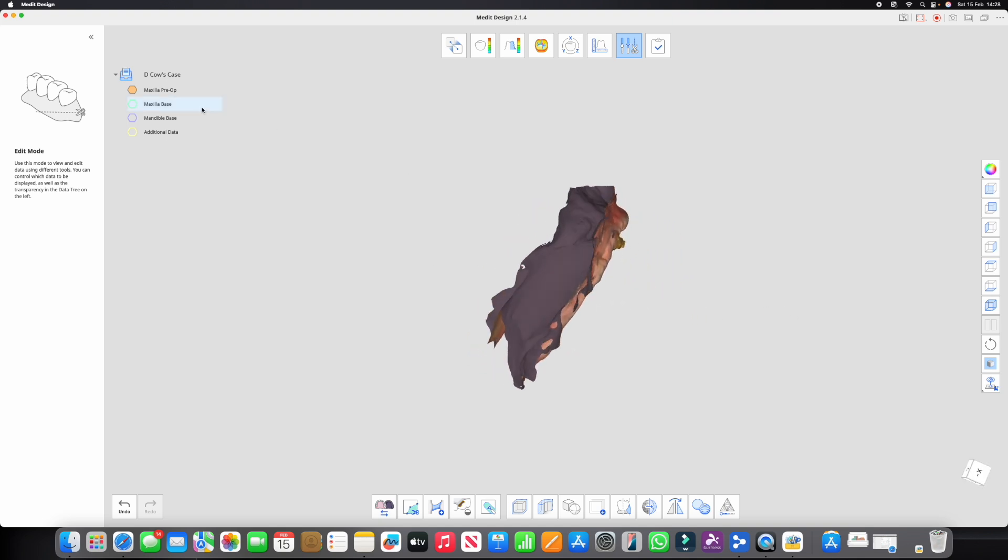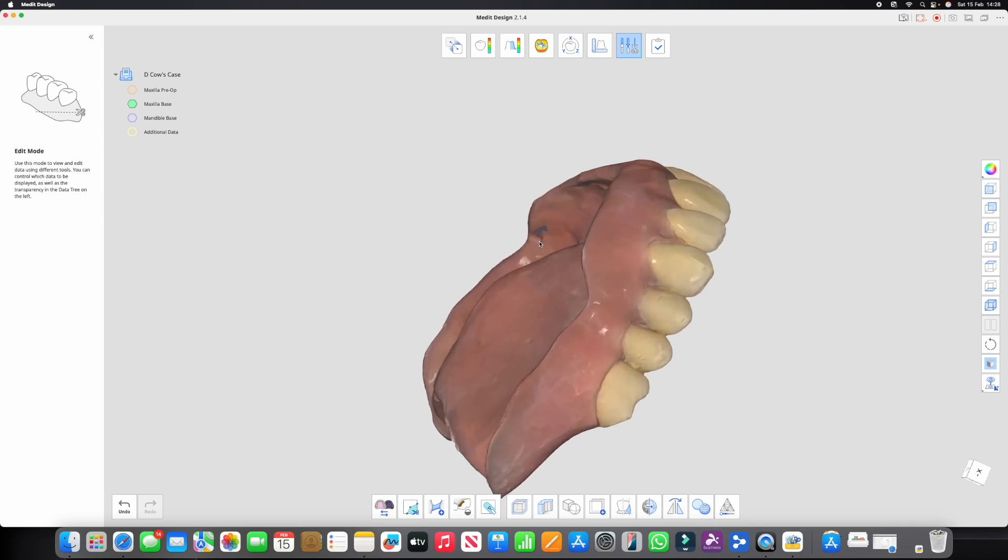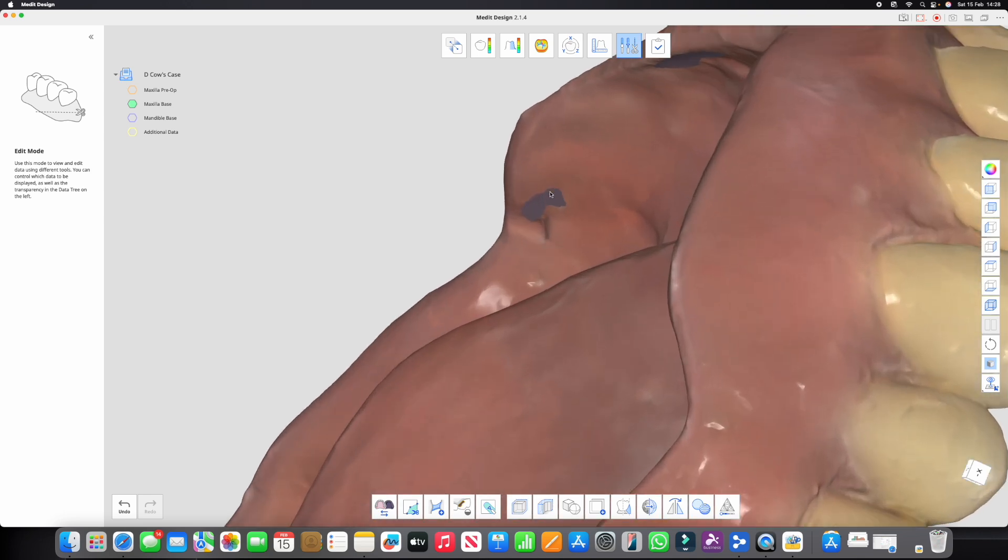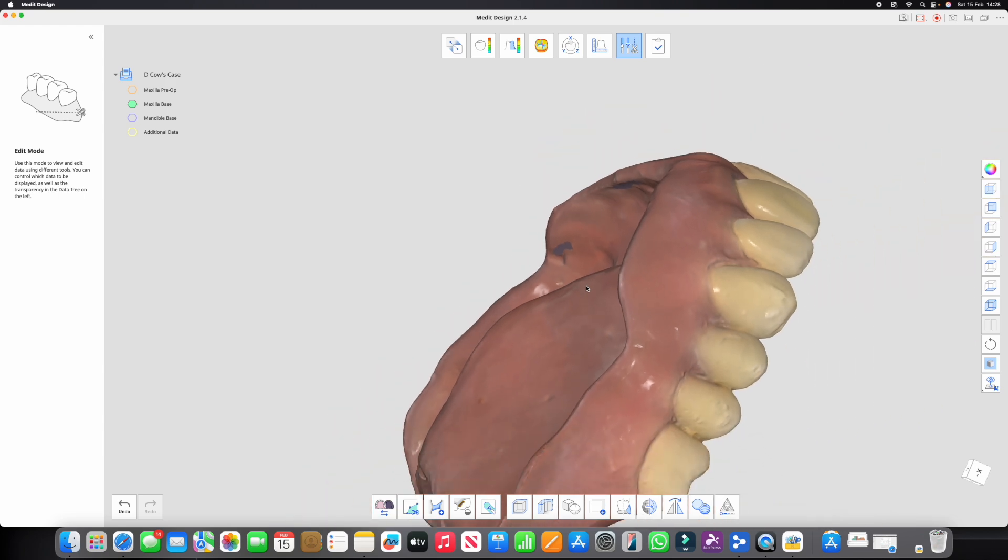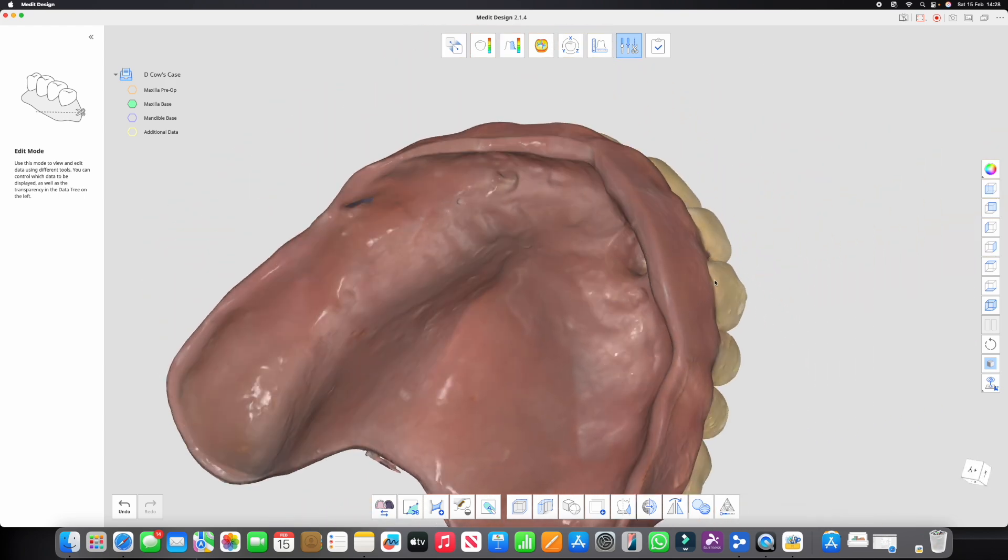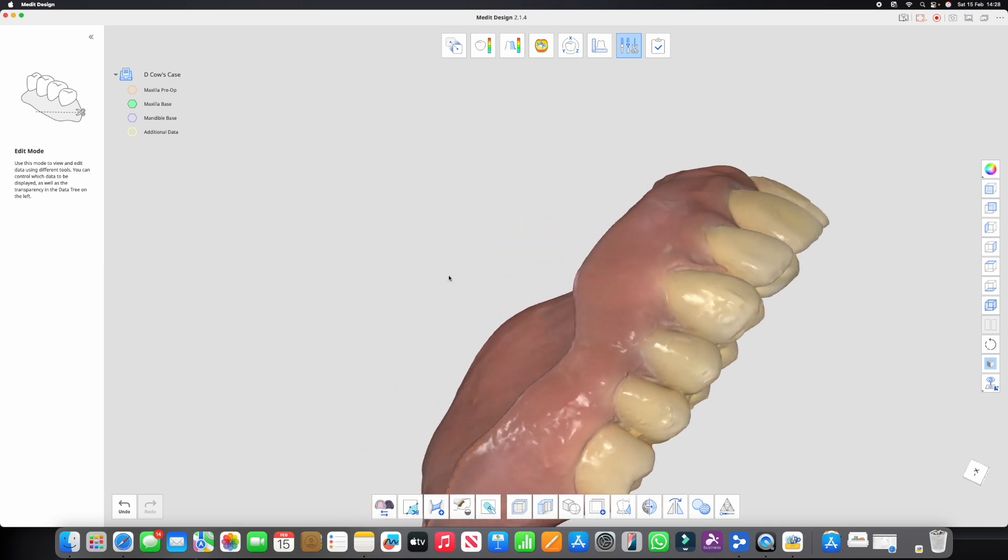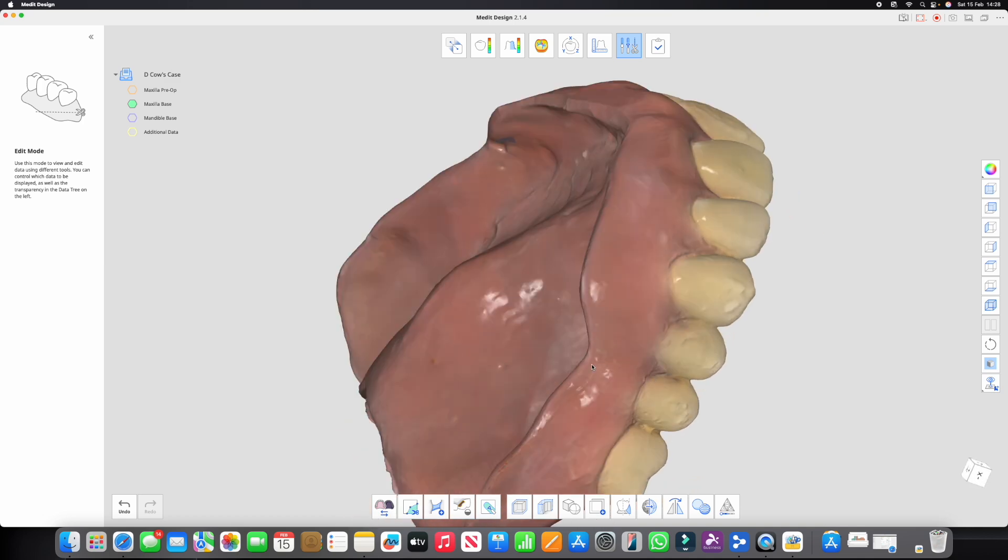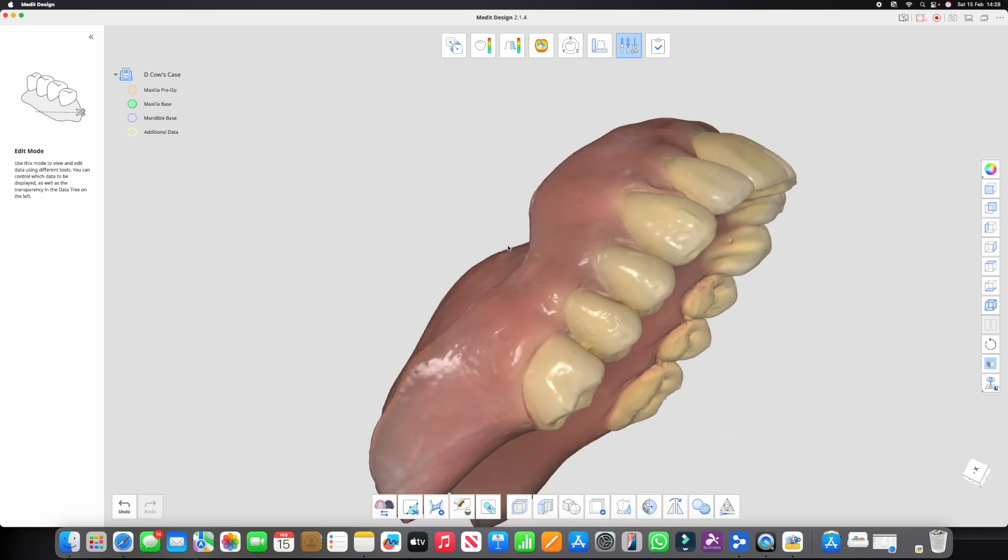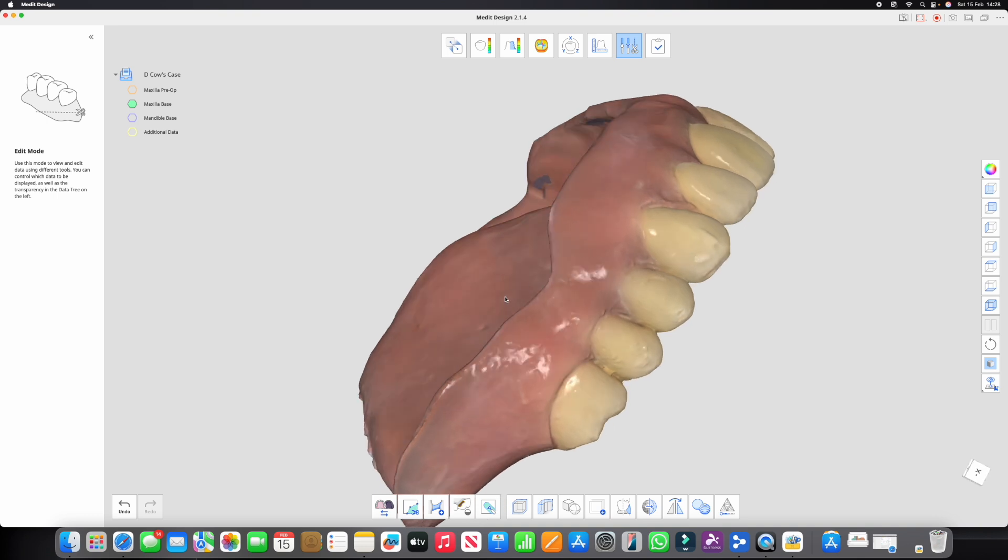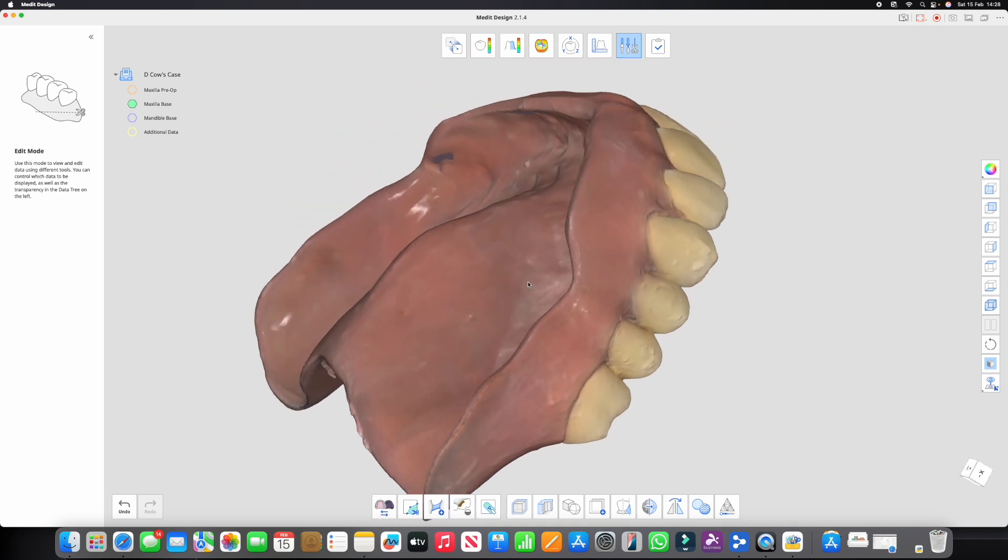If I turn that off and I turn on the denture, this is one solid object and the inside that you can see through this little hole is oriented the wrong way. But the surface of the denture, the fitting surface here, that's pointing outwards, it's activating the wrong way, so we can't align to that because if we try and align to it, it's going to try and flip it over.